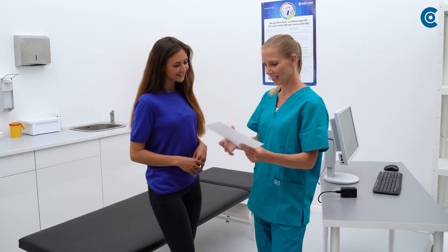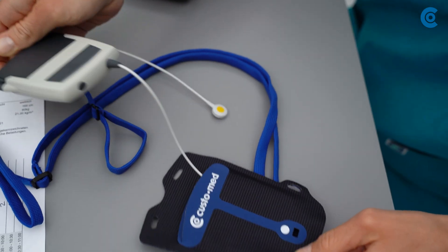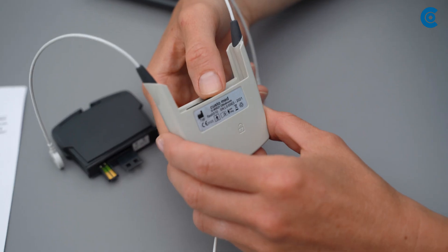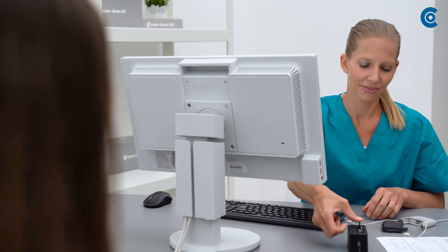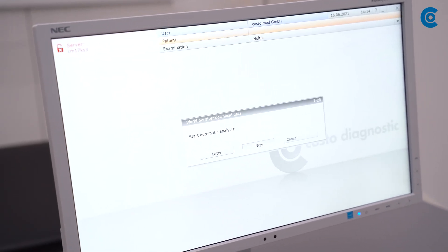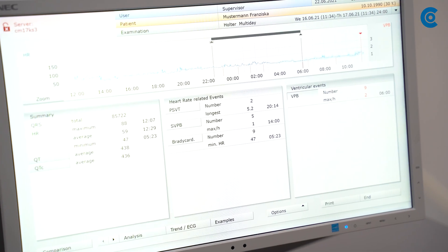Back in the doctor's office, take the diary and the recorder from the patient. Take the recorder out of the carrying case and disconnect the battery by pressing the lock symbol on the back of the recorder. Then remove the Multi-Day card and download the data to Custo Diagnostic via the card reader. You can analyse the recording immediately or later. You can use the patient diary to adapt the day and night phases.